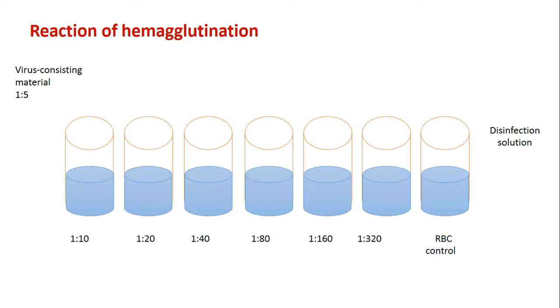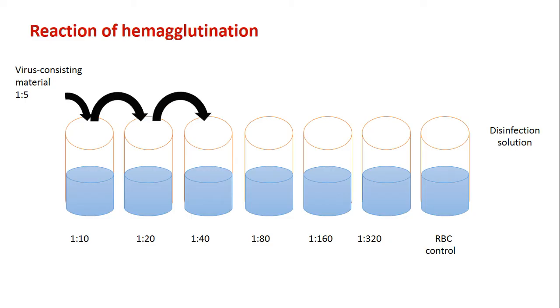After that, we dilute the virus-containing material. The original concentration of virus-containing material is 1 to 5, and we start to dilute it, halving each new dilution. The first tube is 1 to 10, then 1 to 20, 1 to 40, 1 to 80, 1 to 160, 1 to 320, and we exclude the RBC control.